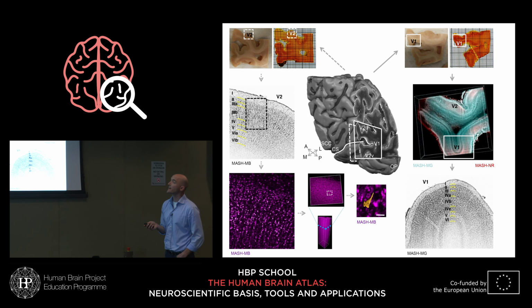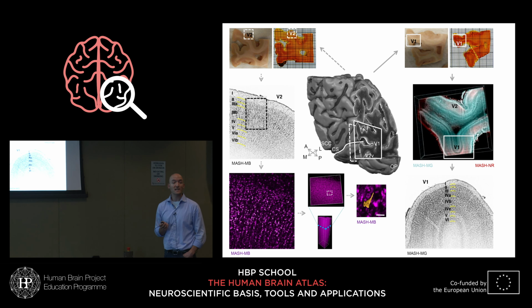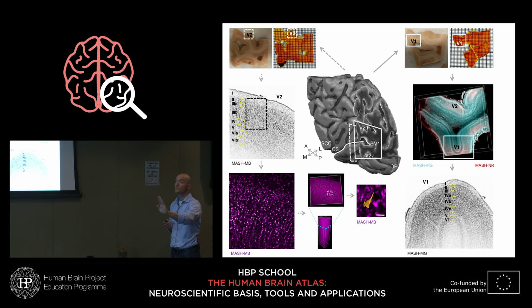And once again, of course, and I will show you the movie, this is in the context of something that is not just a 2D section, which it looks like when I show you the labeled one, but this is in the context of a deep stack that will run all the way through, and will allow this in 3D.